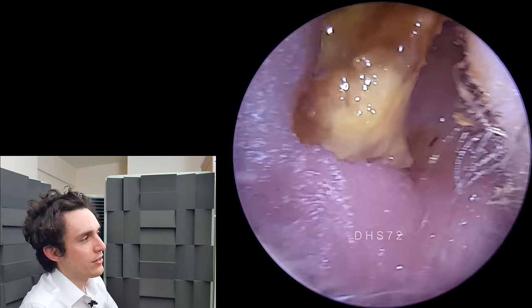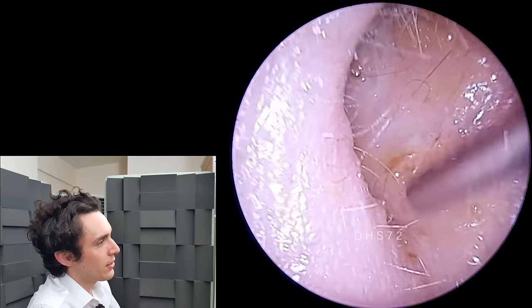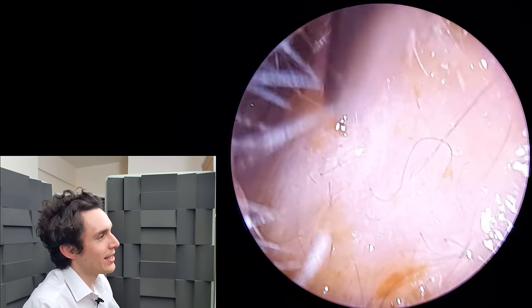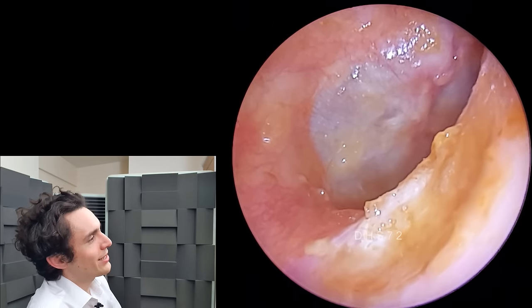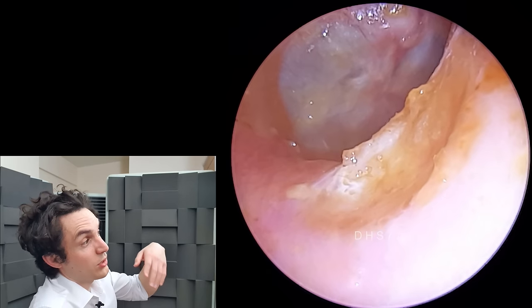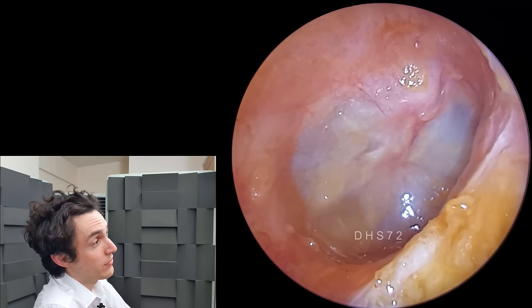And there we go. You can see how oily and gungy it is — super easy. We'll just get rid of that little black hair. There we go. And let's have a look at the eardrum. For one reason or another, the eardrum looks a little inflamed around the handle of the malleus. I rather suspect it's because the wax was obviously pressing on the drum and causing a little bit of irritation.